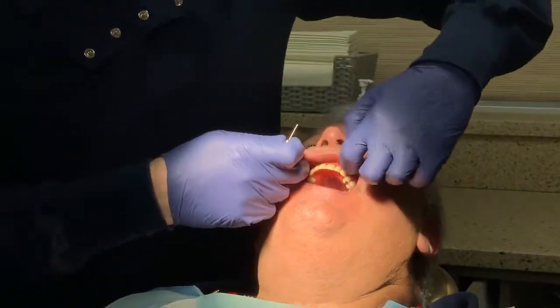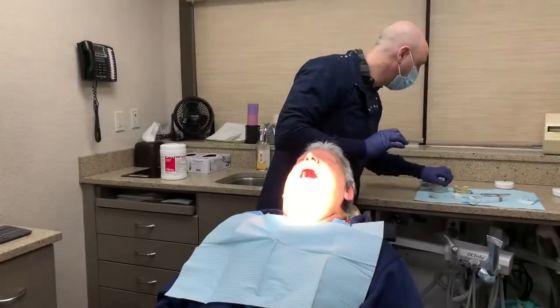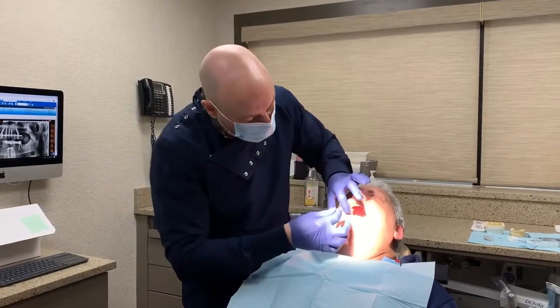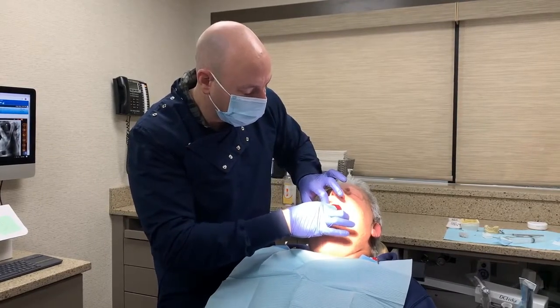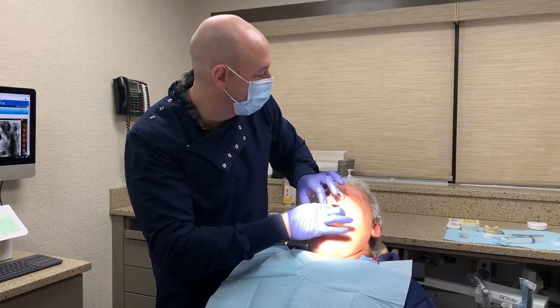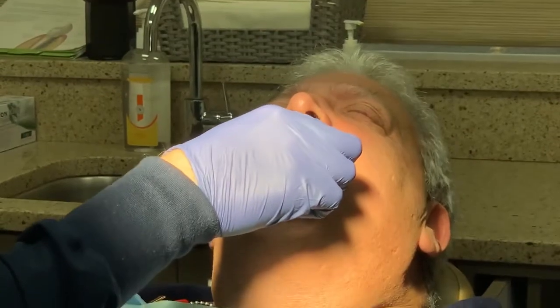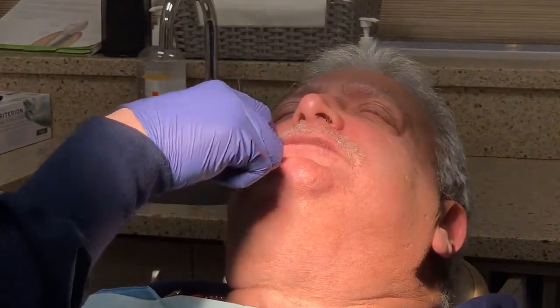You all right? So he kind of flinched a little bit because it's pushing on the tissue a little bit, and you'll see that. And sometimes if it's uncomfortable, or when we deliver the definitive prosthesis, if it's too tight to the tissue, we may have to adjust the intaglio of the restoration so it's cleansable and the patient doesn't have discomfort on the soft tissue. So again, we want to screw all 3 in. Now just gently close down for me. Gently close. Okay, good.